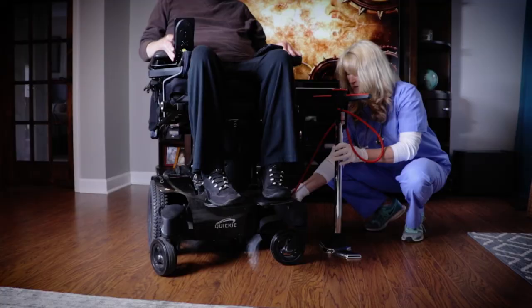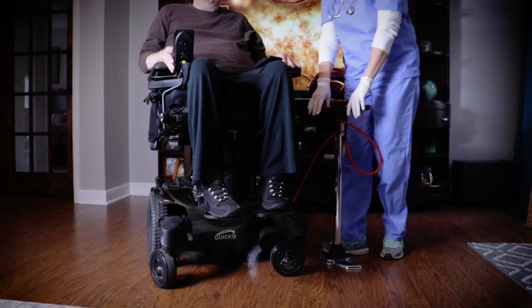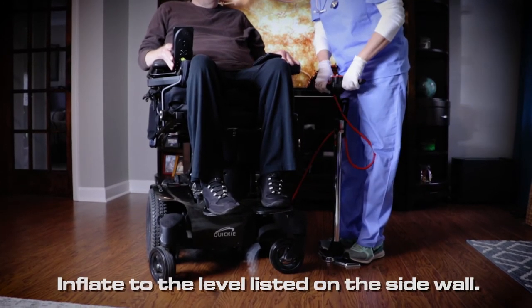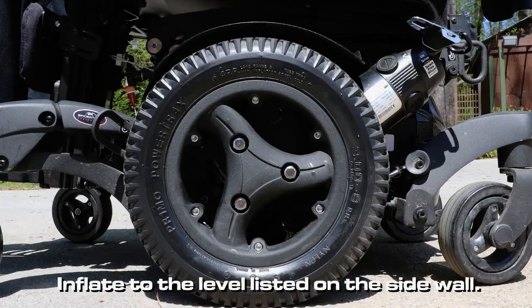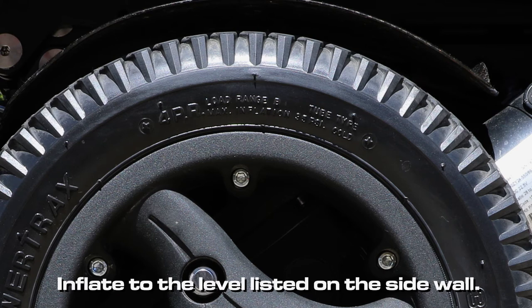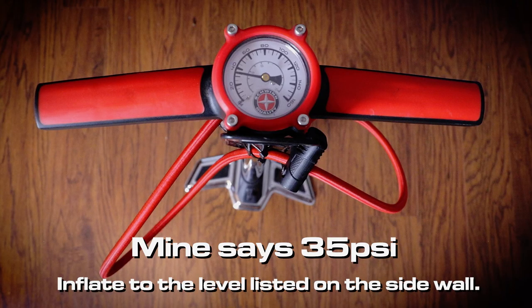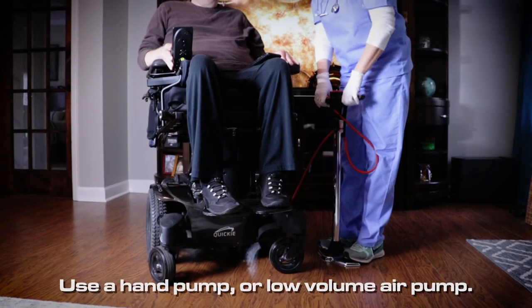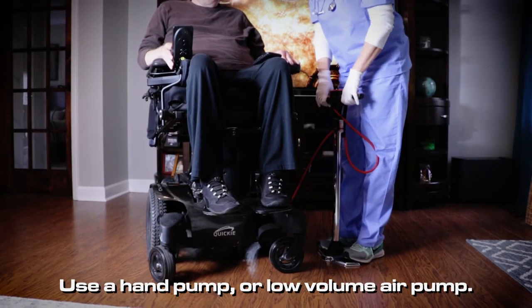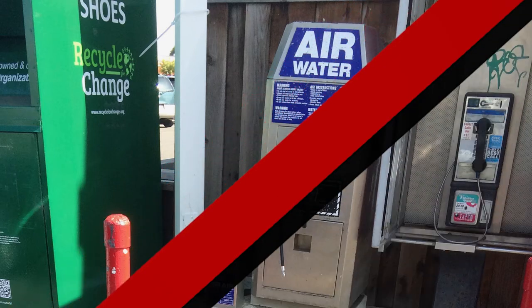Tires — properly inflated? This should be done at least once a week. First, check for signs of wear, then make sure each tire is inflated to the level listed on the side wall, right here. You want the tires to be inflated to between 35 and 45 pounds per square inch, but double check. Fill and watch your pressure gauge. Do the same with each tire. Use a hand pump or low volume air pump — the air pump at the local gas station is a no-no.